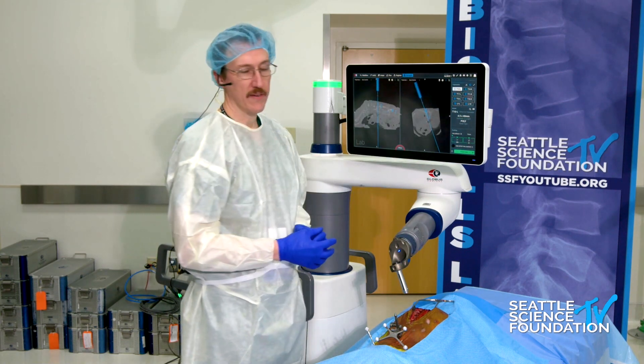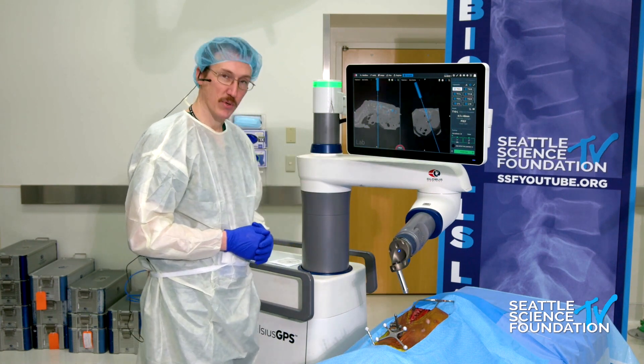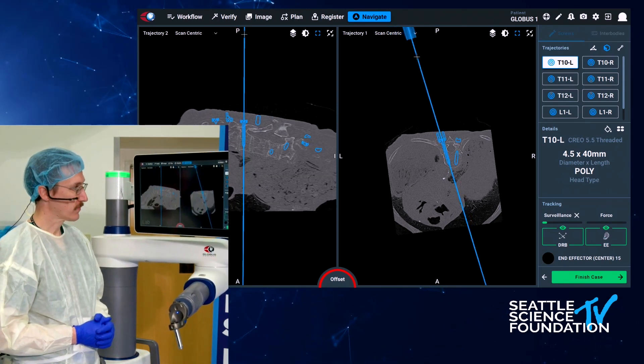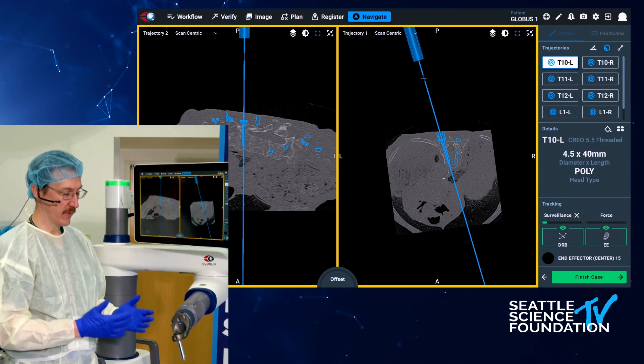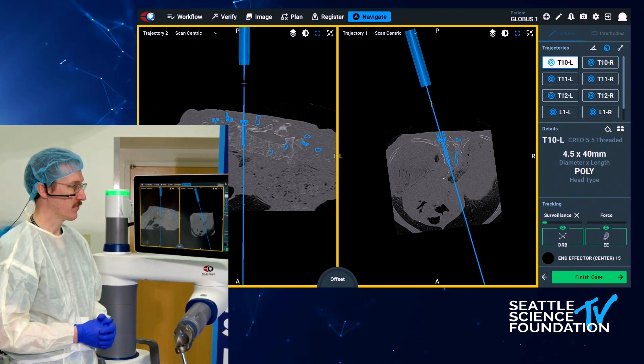We'll start here with the left T10, and this will be an open technique. I have selected the screw. I then press on the foot pedal, and the robot will go to this trajectory. When it's in yellow, it means that we are on the right trajectory, but we're not at the set depth. And then once it turns green, I know it's okay for me to go.